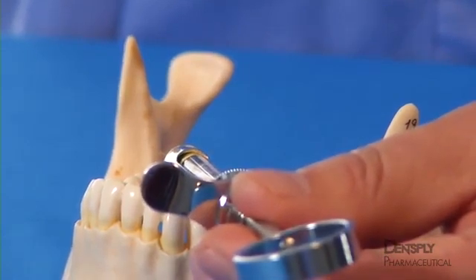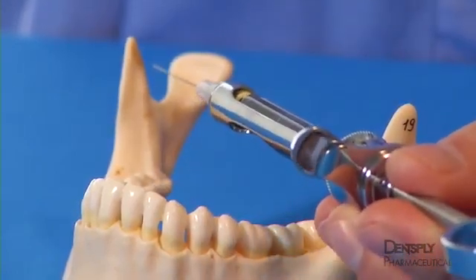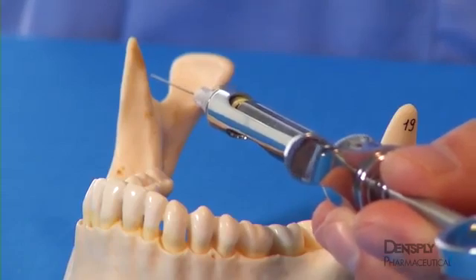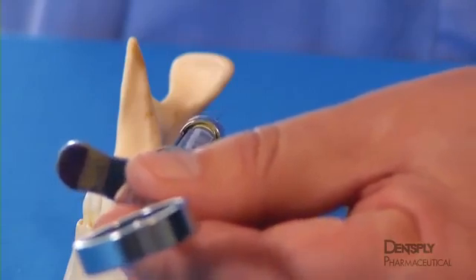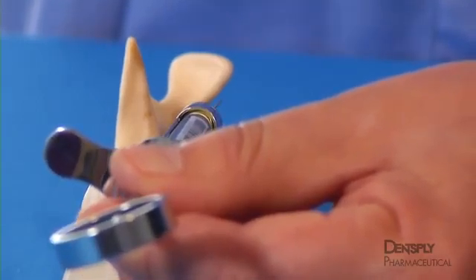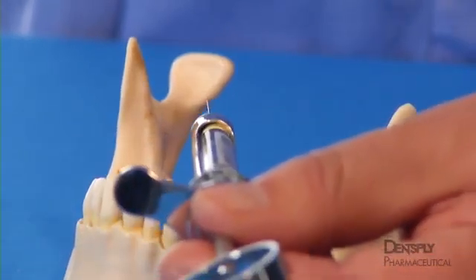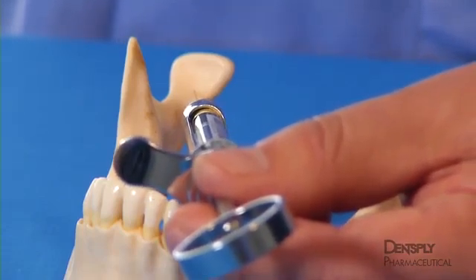It is also possible, though unlikely, that the needle will pass through the sigmoid notch of the ramus without striking any bone at all. Bone will not be contacted either if the angle is insufficient or the insertion point too medial. Correction involves ensuring that the point of insertion is just medial to the deep tendon of the temporalis muscle and appropriately reorienting the barrel of the syringe.